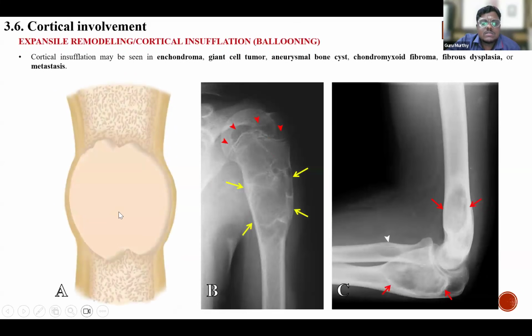The other thing is the bone just expanding. It will show an expansile remodeling. This is also the host response to the neoplasm. There won't be much cortical breach. There might be some small thinning, but the cortex and medullary cavity itself appear as a balloon. So there is cortical remodeling happening in this set of conditions. These are usually seen in benign entities. The cortical breach and the cortical scalloping, which occurs in chondroid tumors, those two are very important features towards aggressiveness.